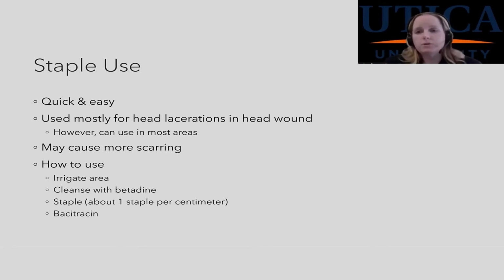It will cause more scarring. Okay. So that's just one thing to keep in mind if you do staple something. Okay. But it is very quick and easy to use. Again, you want to irrigate it, cleanse it with betadine, and about 1 staple per centimeter, and use bacitracin into the area after that.